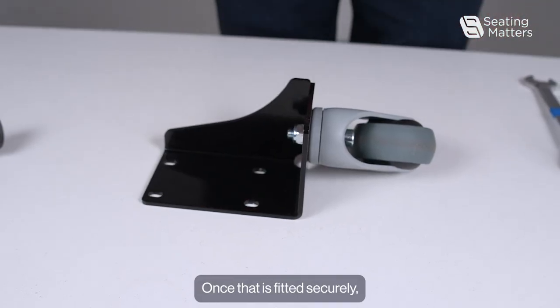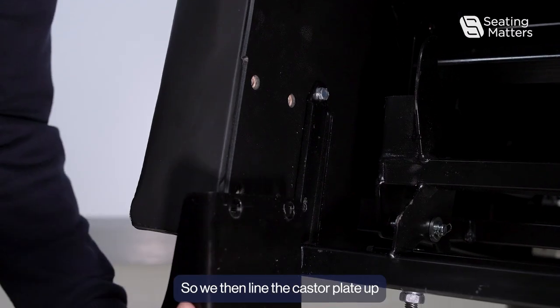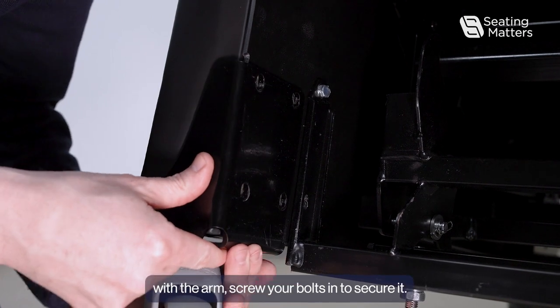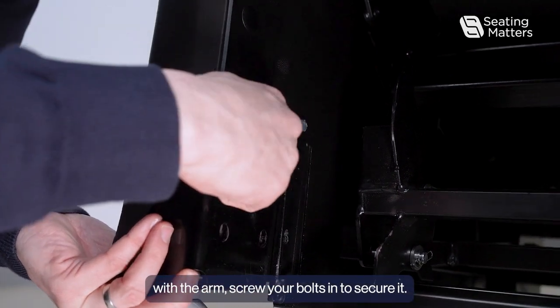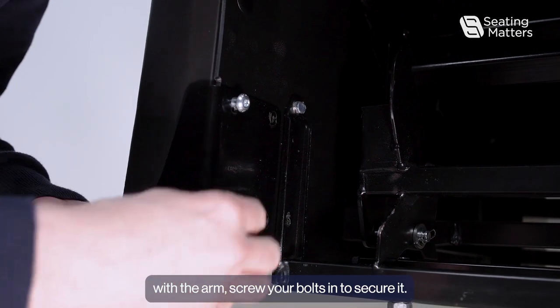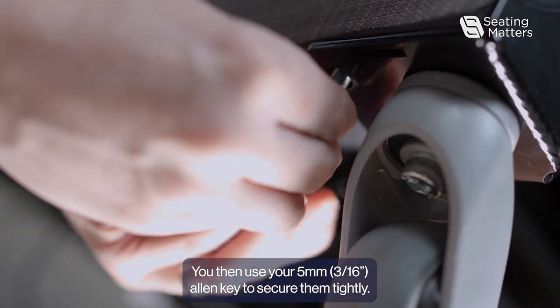Once that is fitted securely, we now need to put the caster plate back on to the front of the arm. Line the caster plate up with the arm and screw your bolts in to secure it. Then use your 5mm Allen key to tighten them securely.